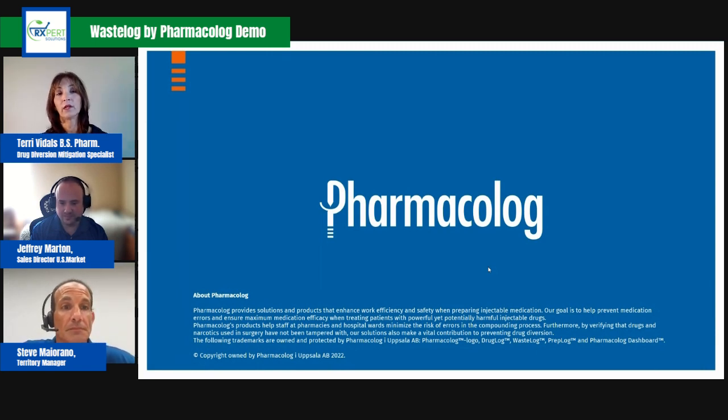Okay. Well, it's great to see these types of products because we all know that waste is an area that is easy for diversion. And of course, if somebody knows that you're watching, then they probably won't use waste as that method. So it's preventative, because you know you're being watched. But it may also force them in a different direction, if they are in a position where this is where they're getting their meds from, so it might be a little more obvious how they're doing it, because we don't know what's in a syringe when it's being wasted.